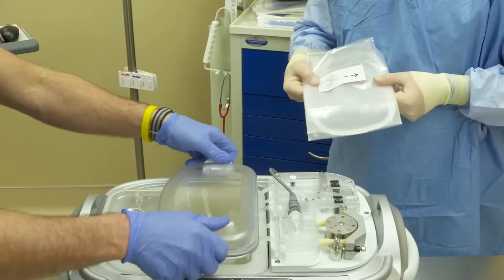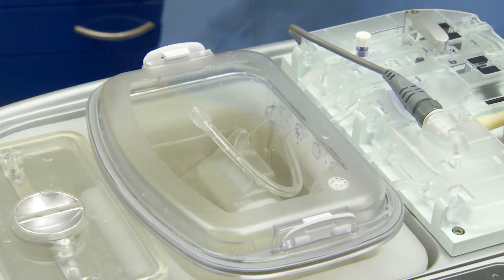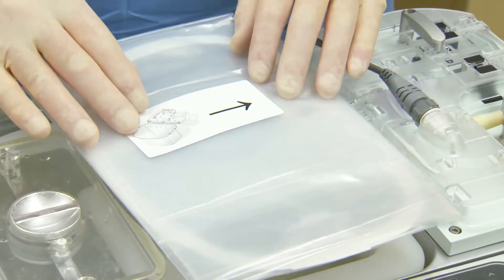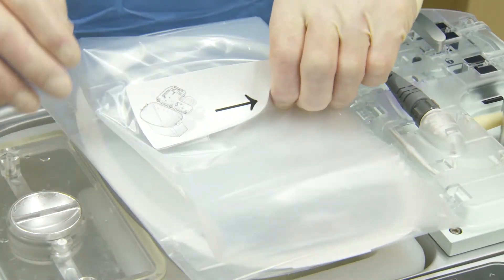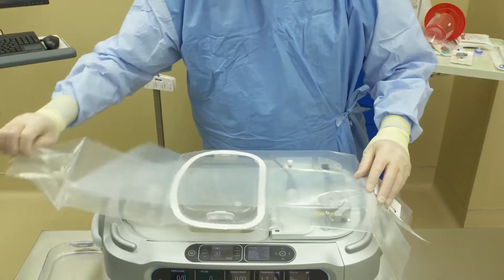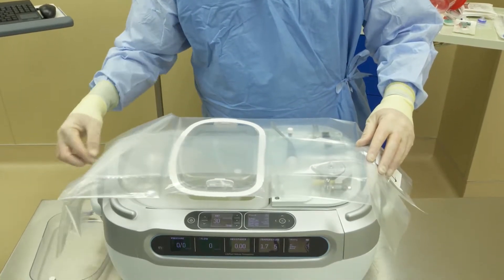First, have someone outside of the aseptic field open the sterile drape and remove the outer lid from the perfusion circuit. Then, position the folded sterile drape over the perfusion circuit. Unfold the sterile drape along the length of the Lifeport.